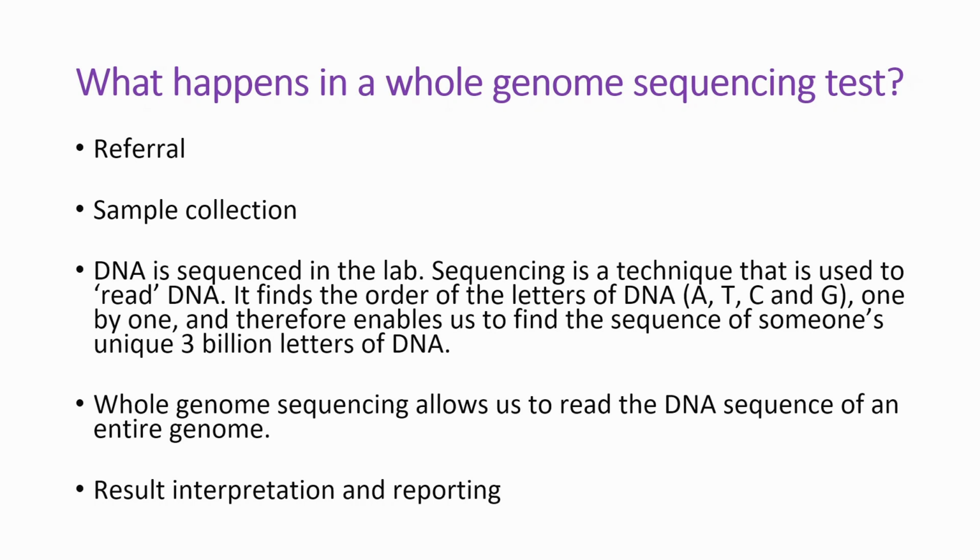the genomic testing laboratory. In our lab, we carry out extraction of the DNA from the blood sample, and the quality of the DNA is checked to see if it's suitable for genomic testing. So batches of the samples are then sent to another lab who carry out the whole genome sequencing laboratory work, and the DNA samples from all NHS genetic labs in England are sent to this central facility in Cambridge.